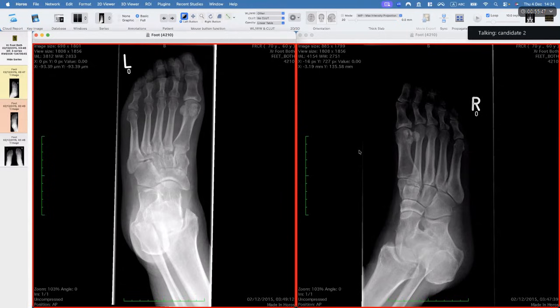In the early stages, there might be a mild joint space reduction, some amount of marginal osteophytes, some sclerosis along the articular margins, and some subchondral cystic changes because of the degeneration of articular cartilage along the joint surfaces. In the chronic stages there can be complete loss of joint space. Okay. All right.